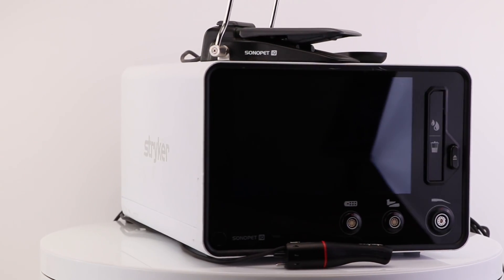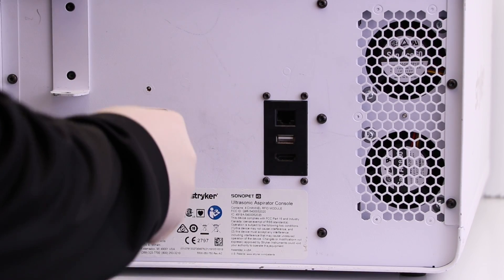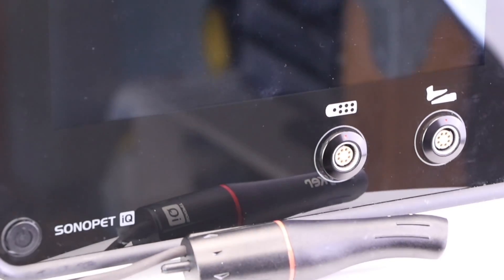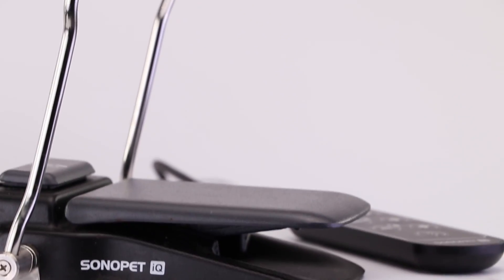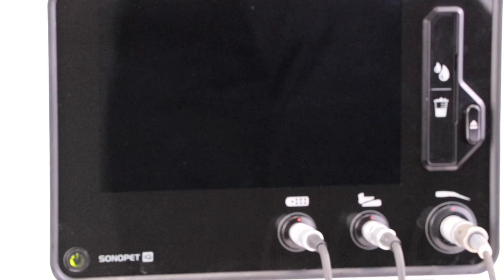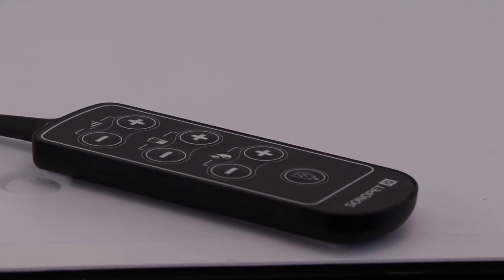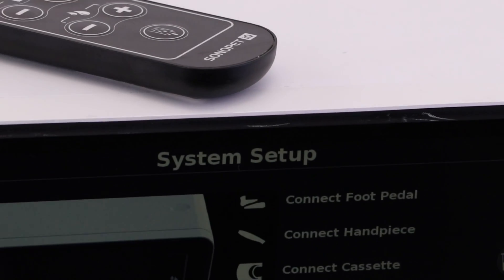The Sonopet IQ uses an exclusive blend of radio frequency identification technology and algorithms to create an on-demand customized performance that automatically adjusts settings to optimize performance throughout your entire procedure. It also offers RFID-enabled intelligence transfer to create and store your custom user profile and preferences for peripheral devices, so once you set up the first time, it's always ready to engage when you are.